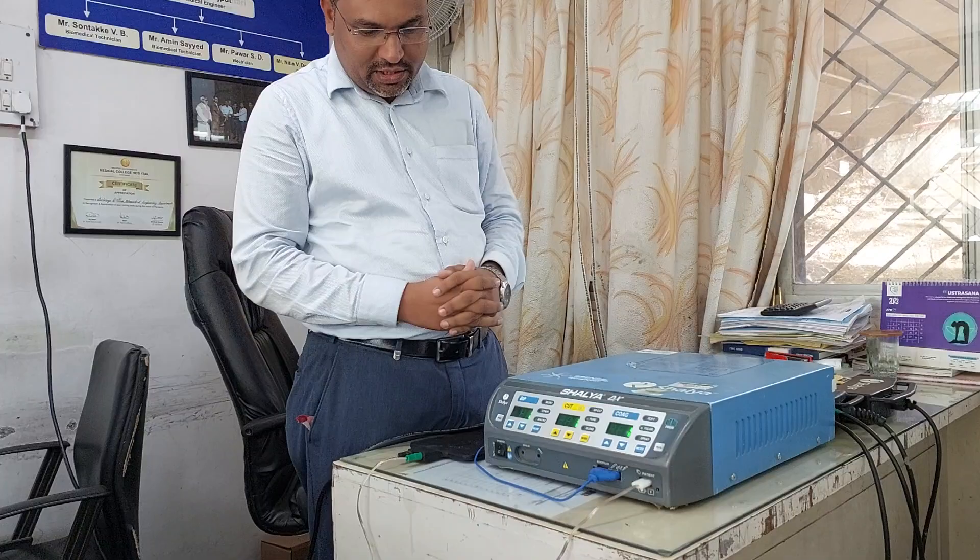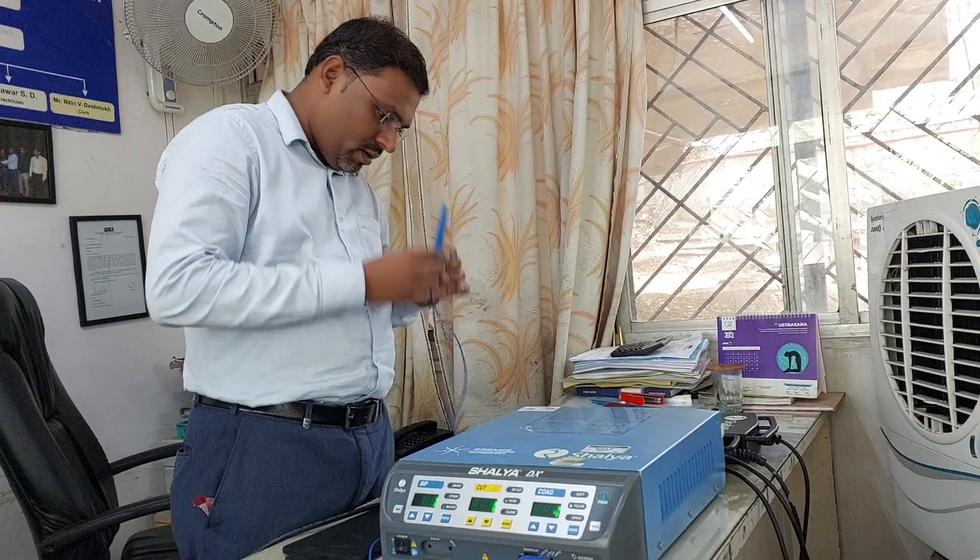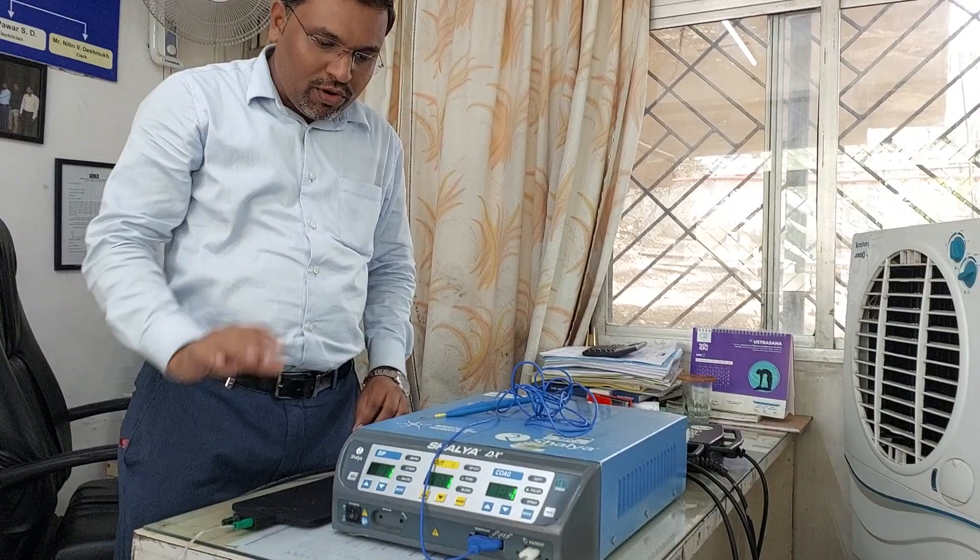At the time of switching on, the machine will self-analyze all the things. Now the machine is on. I have connected the monopolar electrode, so now I will show you how to test whether the machine is working or not.